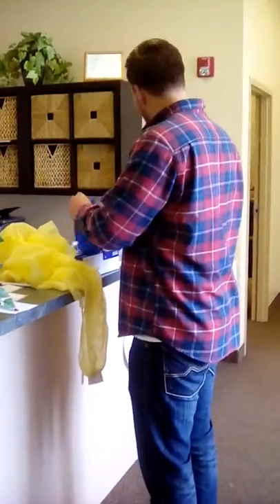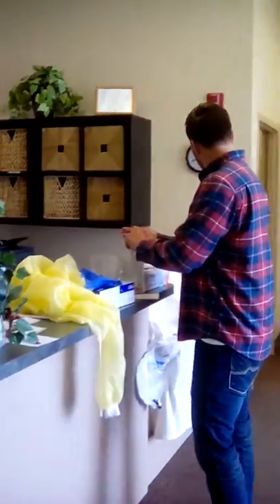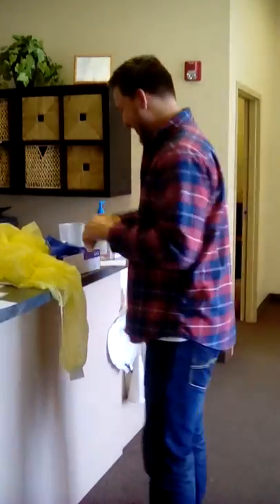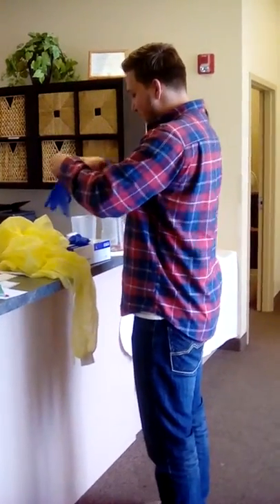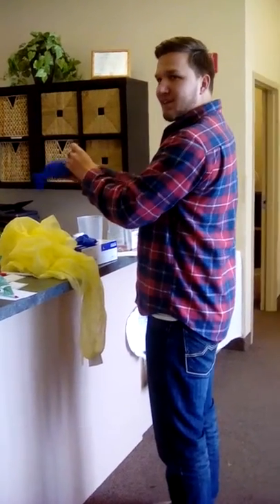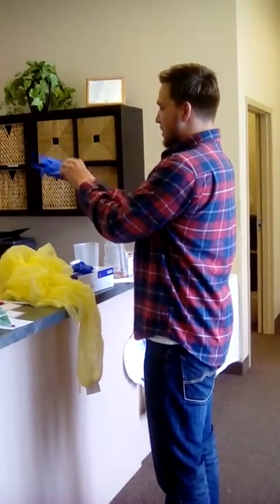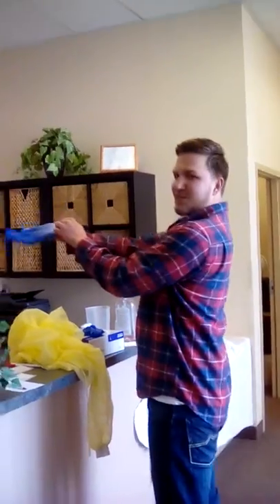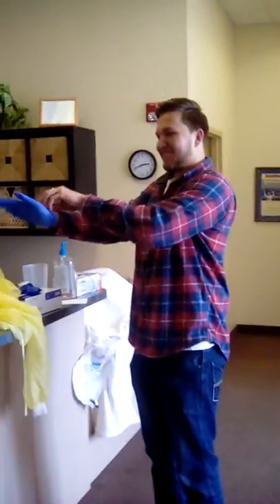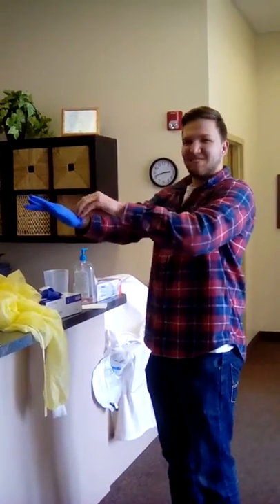I'm going to quickly put on my gloves after I perform my hand hygiene. Putting on wet gloves is not easy, as you can see.